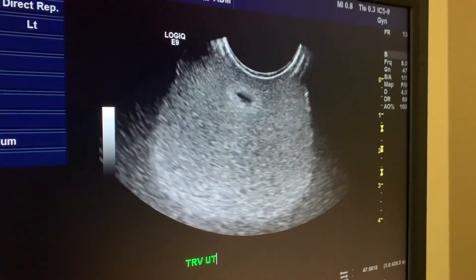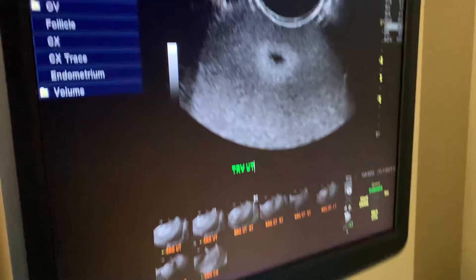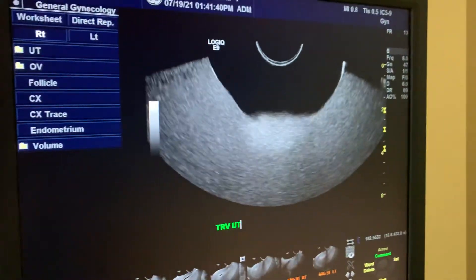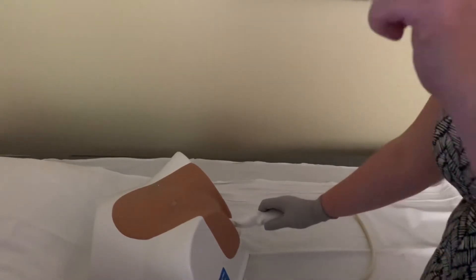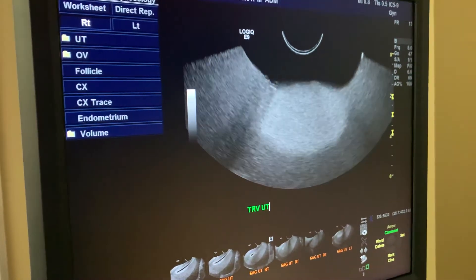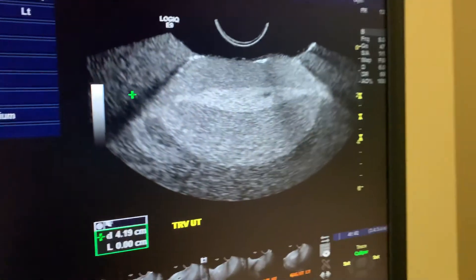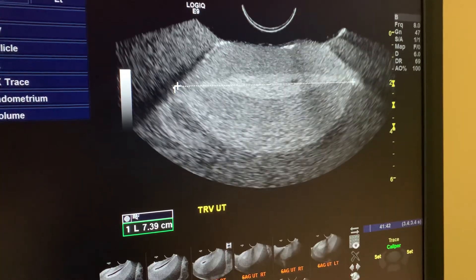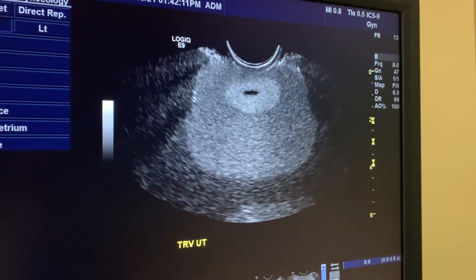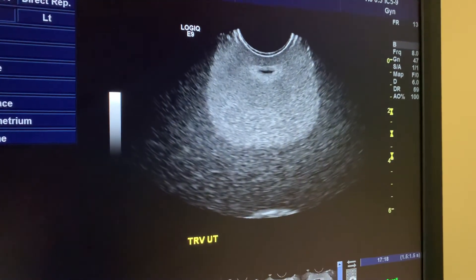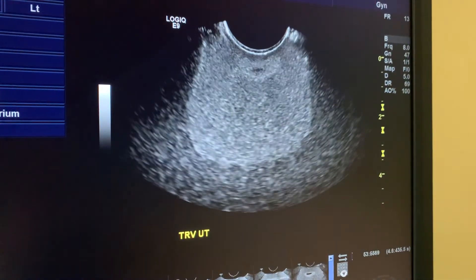Now I turn the probe from sagittal to transverse for the transverse measurement. To get all the way up to the fundus, I angle the probe upwards by pushing the handle down. At the fundus, the cornua come in — this is the widest portion of the uterus — and we measure from here to here. Then I sweep down, taking slices and images throughout the uterus.